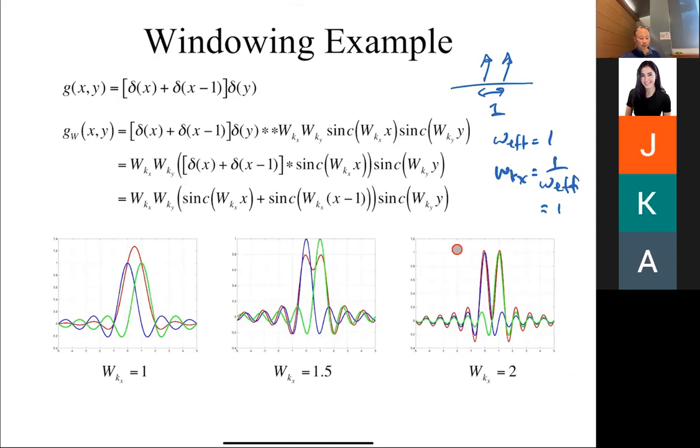So it turns out that resolution is one of those things that is somewhat subjective, right? You can say, I want a resolution of 1 millimeter or 1 centimeter, but then the images come back and you're like, I really want to be able to resolve these two things that are really close together. And so you might actually then have to iterate and say, well, given what I'm looking for, maybe I actually need higher resolution. Okay, so that's a design decision that you have to make.